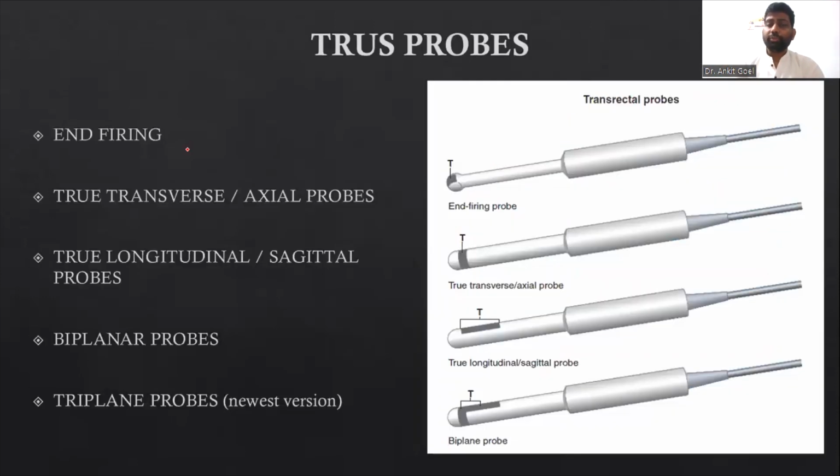These are the different probes which are available for a transrectal biopsy. We'll quickly discuss the transrectal biopsy and then we'll talk about the transperineal biopsies. There are end-firing probes and side-firing probes. Now we also have combined probes.